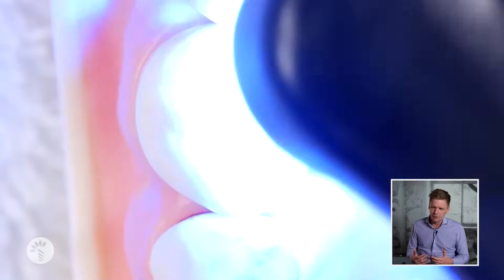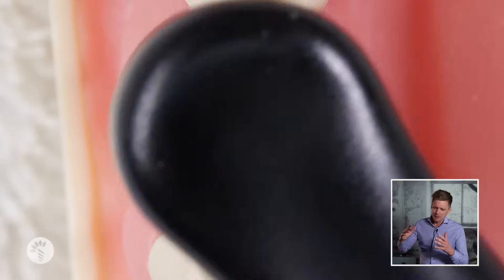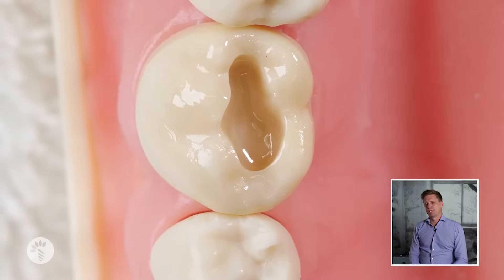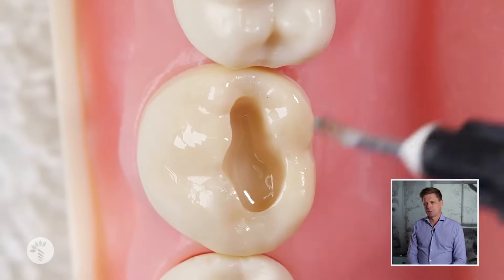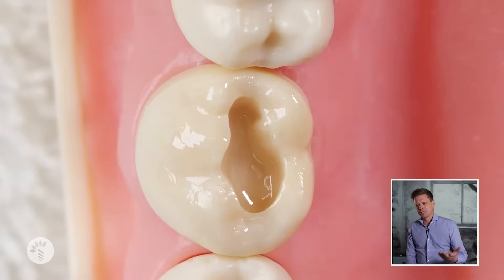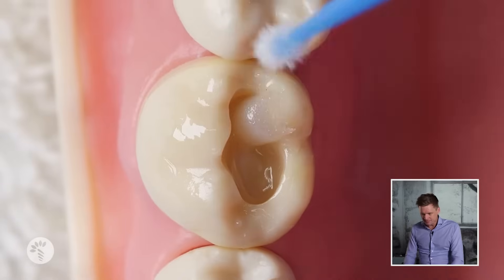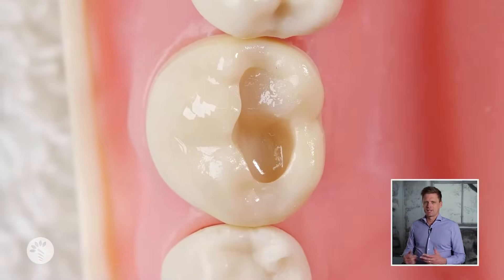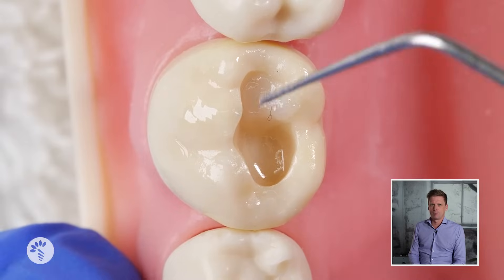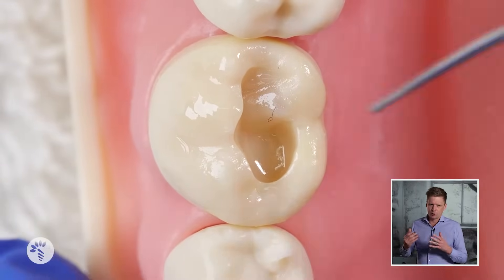Then we use a little bit of flowable in the base of the cavity. This is to reinforce the bonding agent because the C-factor — the shrinkage cavity factor — for Class 1s is the worst of any type of cavity. Once we've filled it up to the enamel layer, we can build one cusp at a time if we're trying to do a more fancy design.